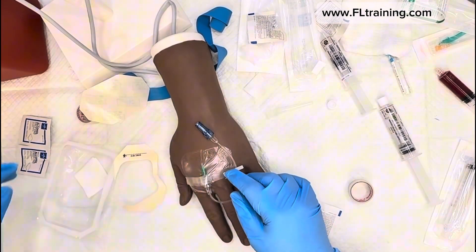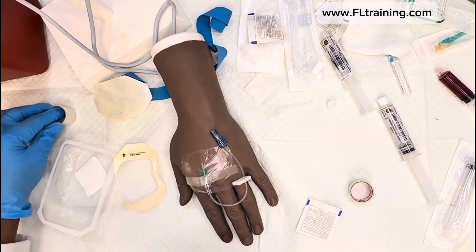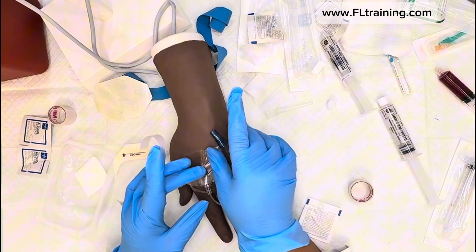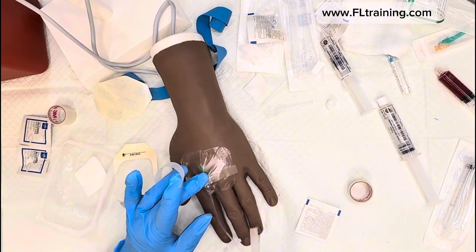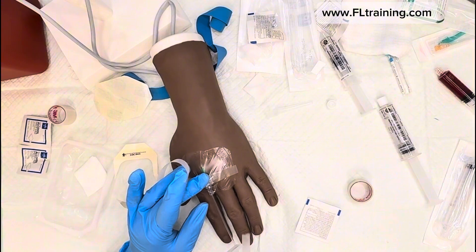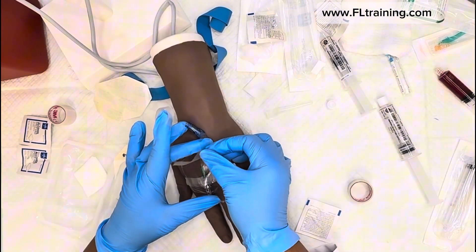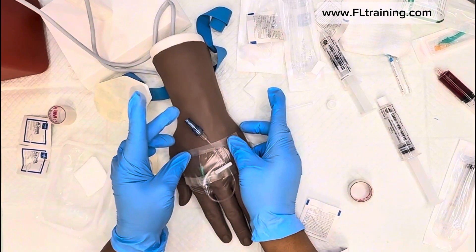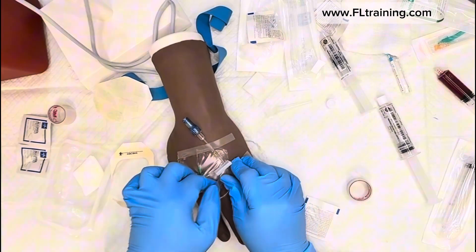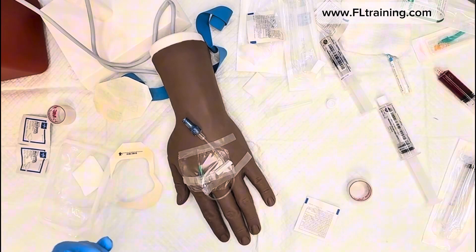I like to use a J-loop to secure my connecting tubing. The purpose of the J-loop is to reduce tension — if you have the tubing going straight, the patient could turn the wrong way and pull the catheter straight out. With the J-loop, it's harder for the tubing to get caught on surfaces or clothing, and it keeps everything in place.